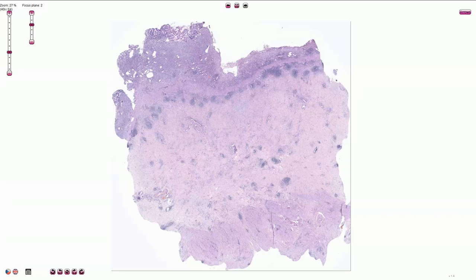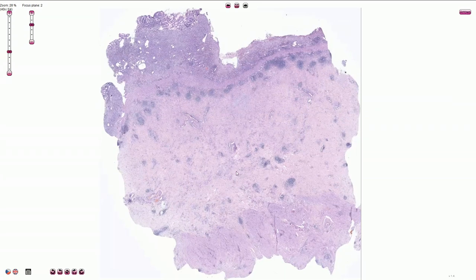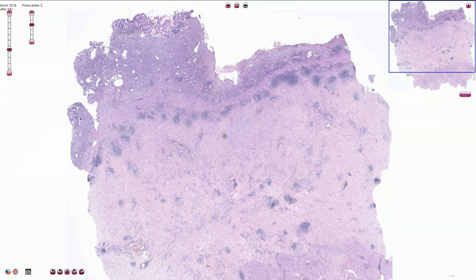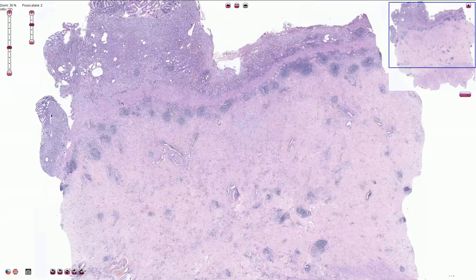We have two main categories of gastric adenocarcinoma. The first one is the intestinal type, which creates glandular, tubular, or papillary structures. The second one is poorly cohesive gastric adenocarcinoma, also called diffuse adenocarcinoma. This is an example of the stomach being infiltrated by the poorly cohesive gastric adenocarcinoma.